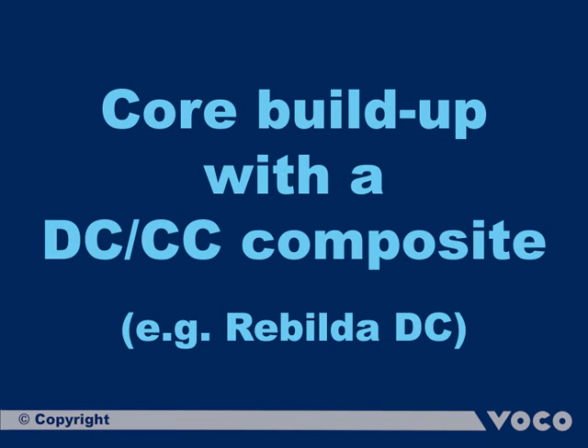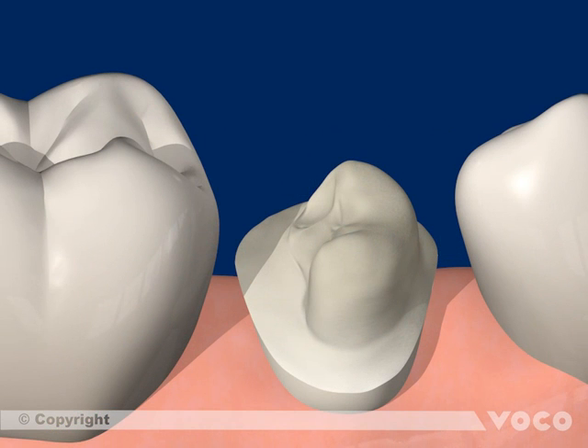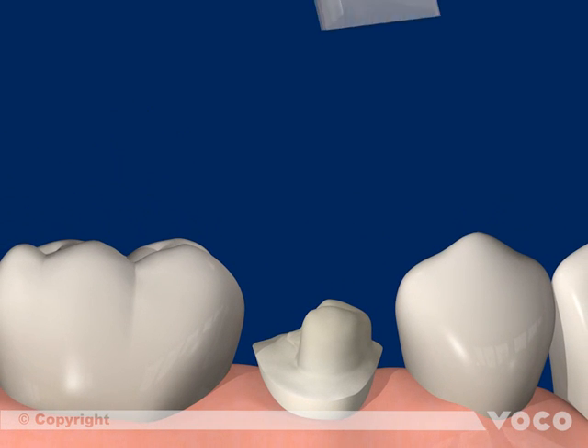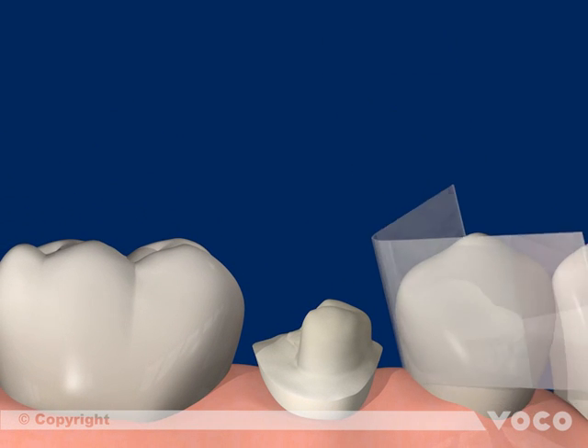This sequence shows the adhesive Core Build-Up with a dual curing Core Build-Up Composite. The neighboring teeth must be protected from this procedure.